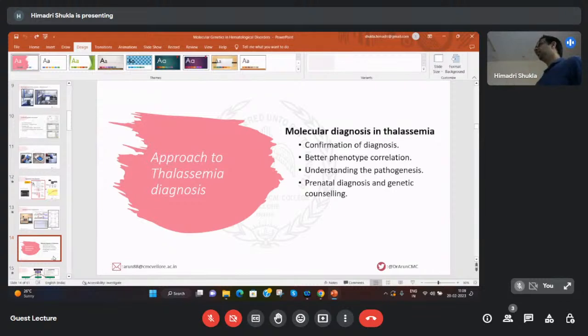We need to have a molecular diagnosis to diagnose thalassemia, or you can say I can confidently diagnose with my peripheral blood, and maybe not peripheral blood, but with an HPLC for sure. So yeah, you may not need it in all scenarios. Your HPLC is an extremely useful test, and most of the time it can give you a clearer picture. But for every diagnosis that you make by HPLC, you will have at least 3 or 4 differential diagnoses.